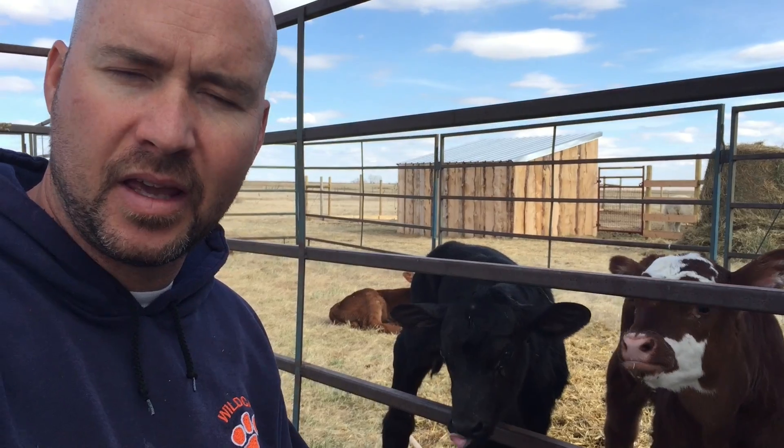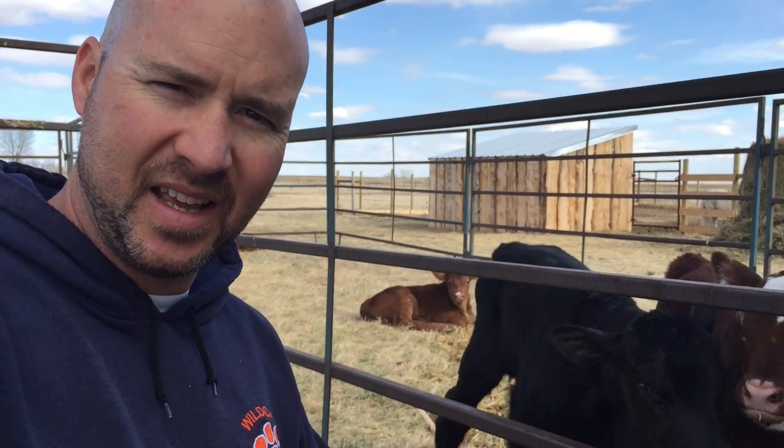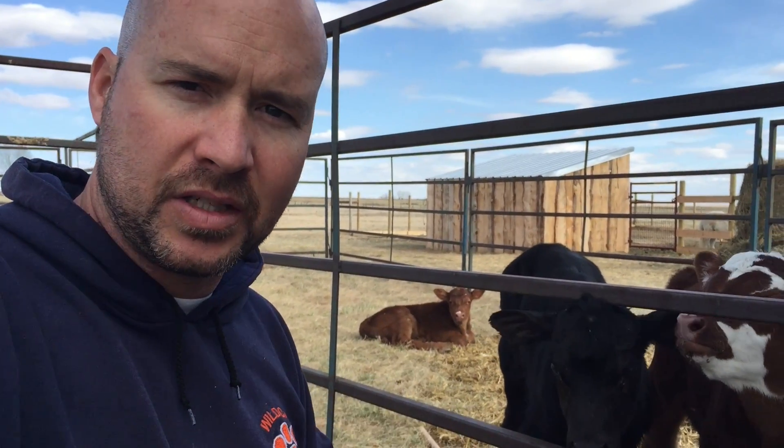Hey guys, Jeremy here with Simple Little Life and today is day 10 of the 30 day video challenge. What we're doing today is we have a calf — that little white-faced brown guy at the back there — and she's not taking her bottle like she was before.